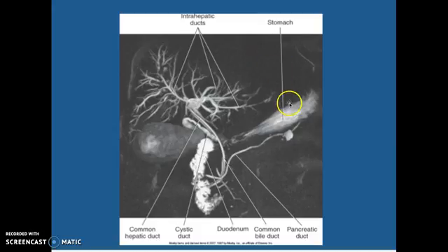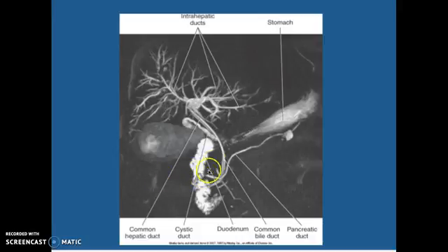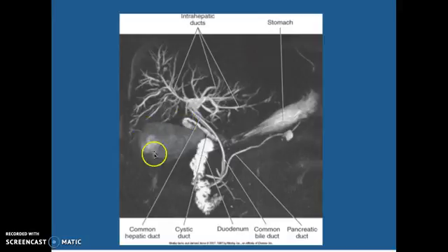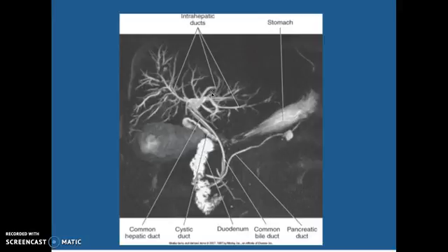This is an MRCP that we run. This is your duodenum coming down. You can see your pancreatic duct coming across, coming up your common bile duct, and then you can see your cystic duct right there with your gallbladder. You can't really tell which is the left and right of your hepatics.